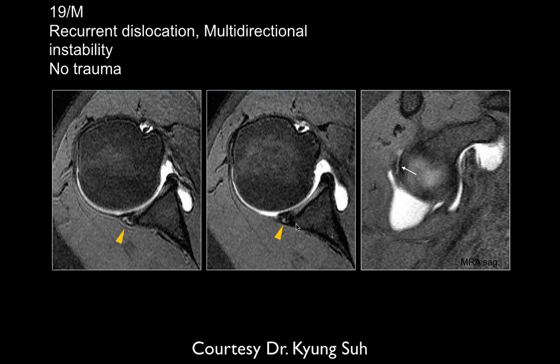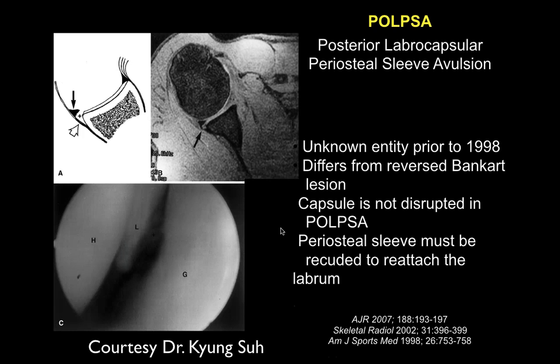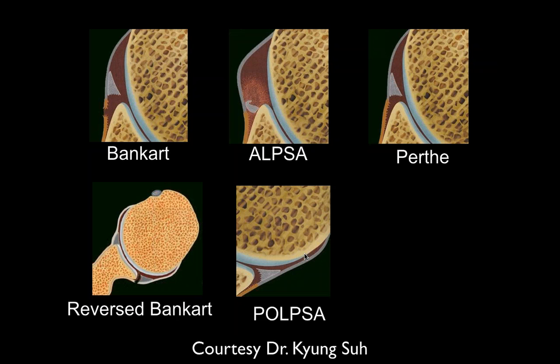Okay, so it's going between the labrum and articular cartilage? The articular cartilage is over here, and that area looks pretty good. So it's more in the body of the posterior labrum. And then this just shows the periosteal attachment to be intact.